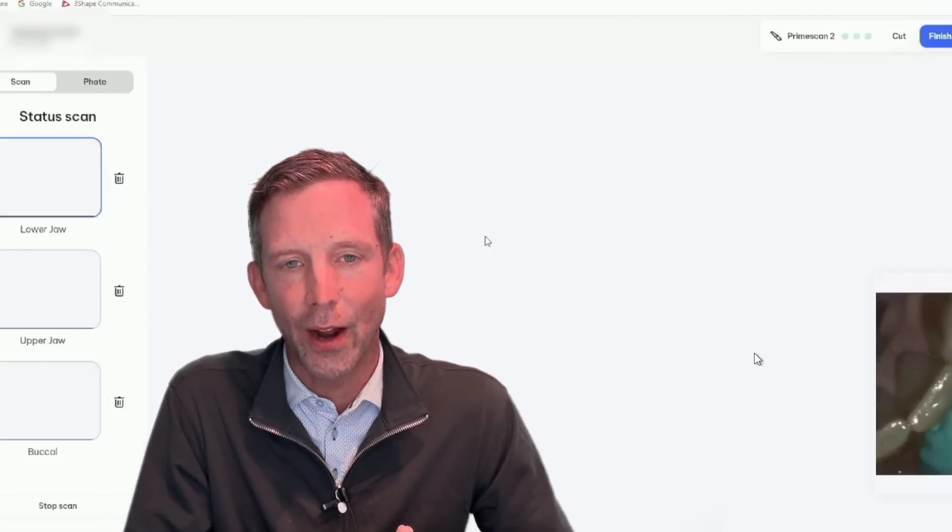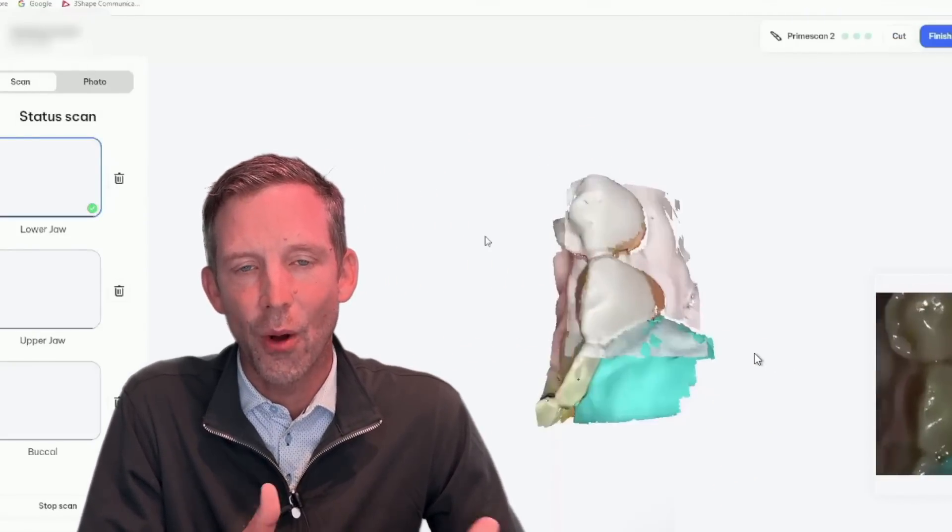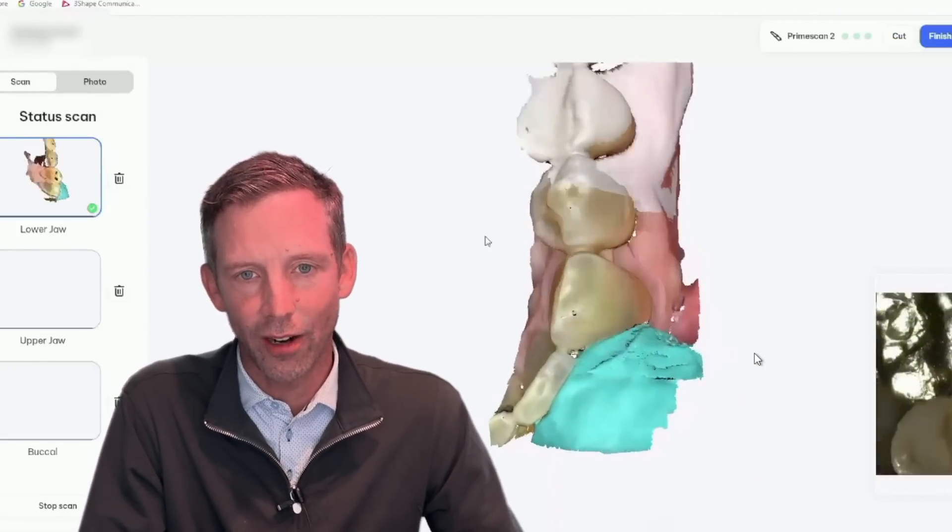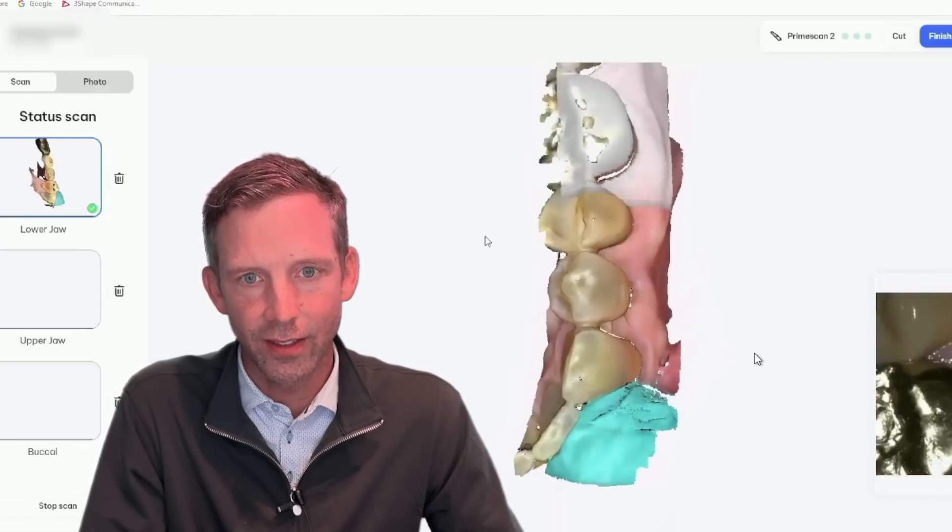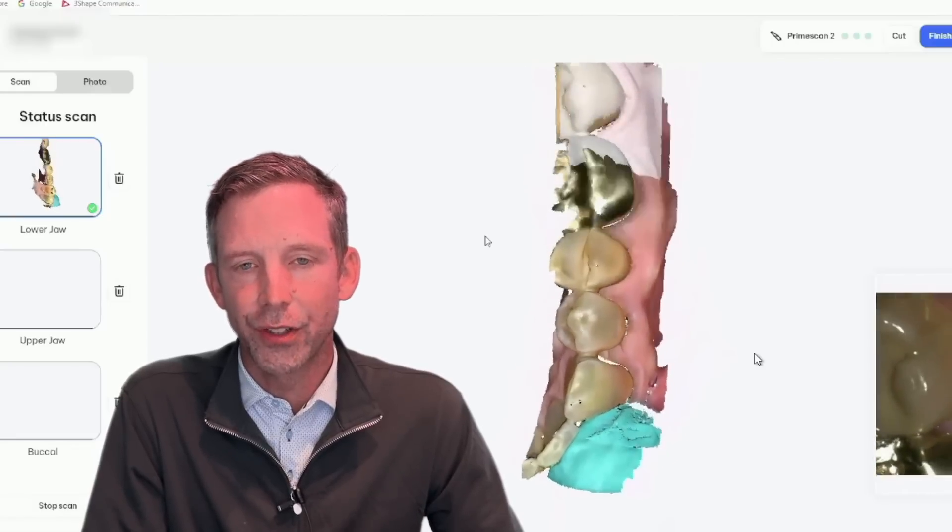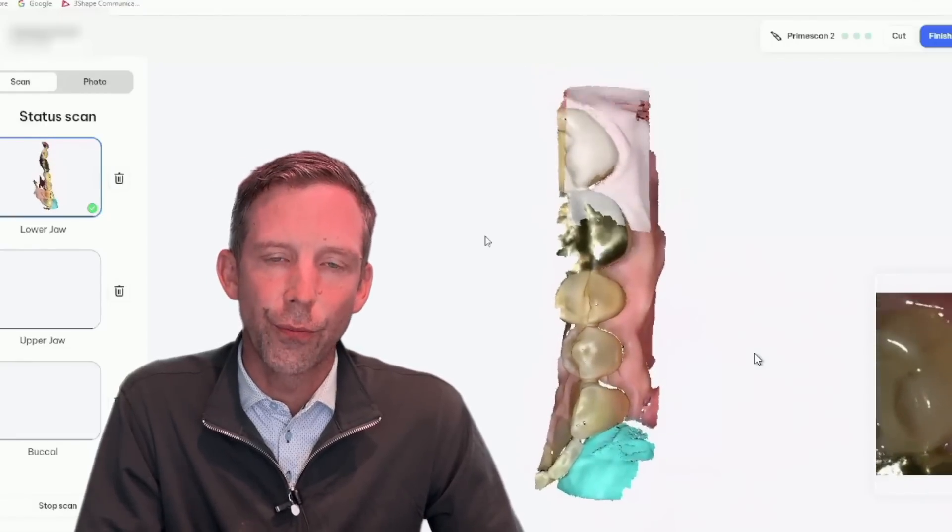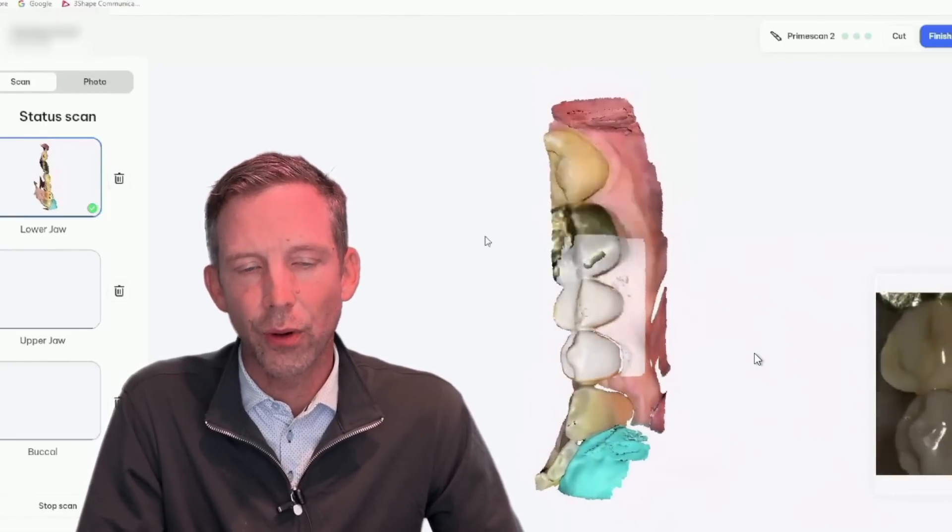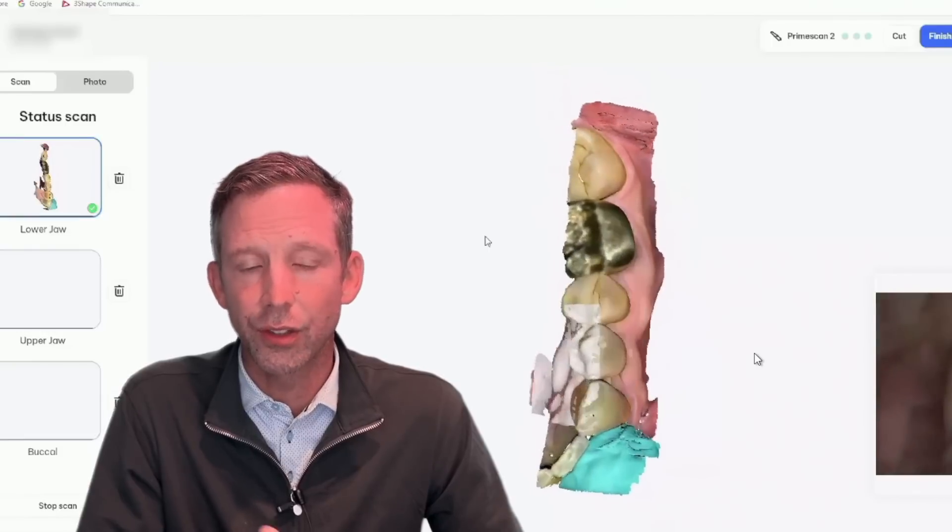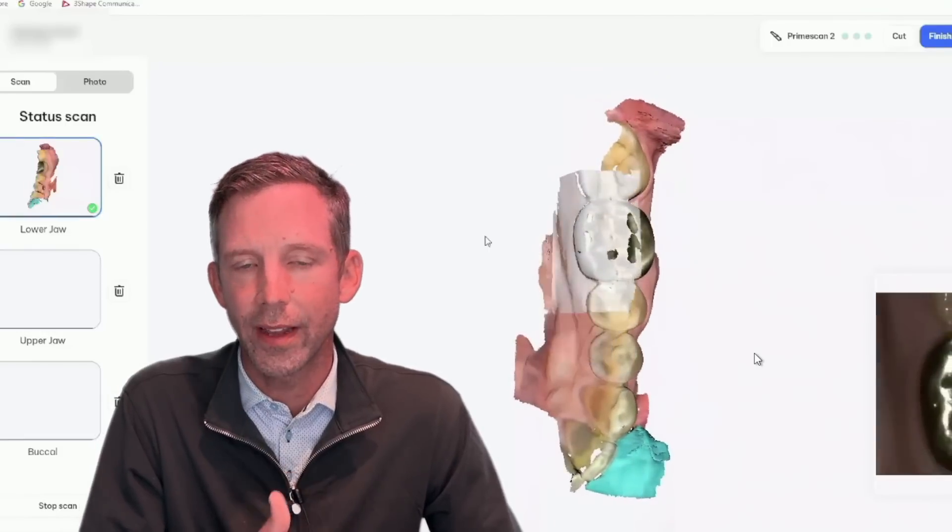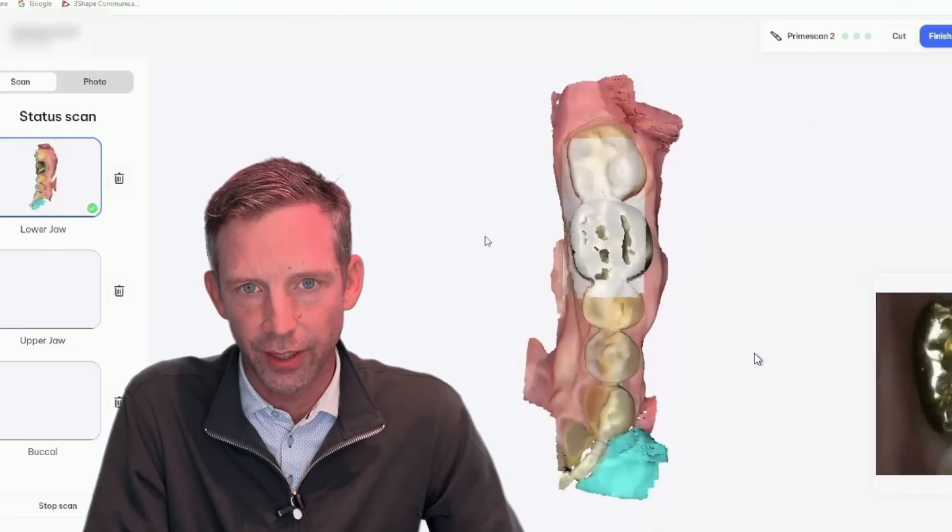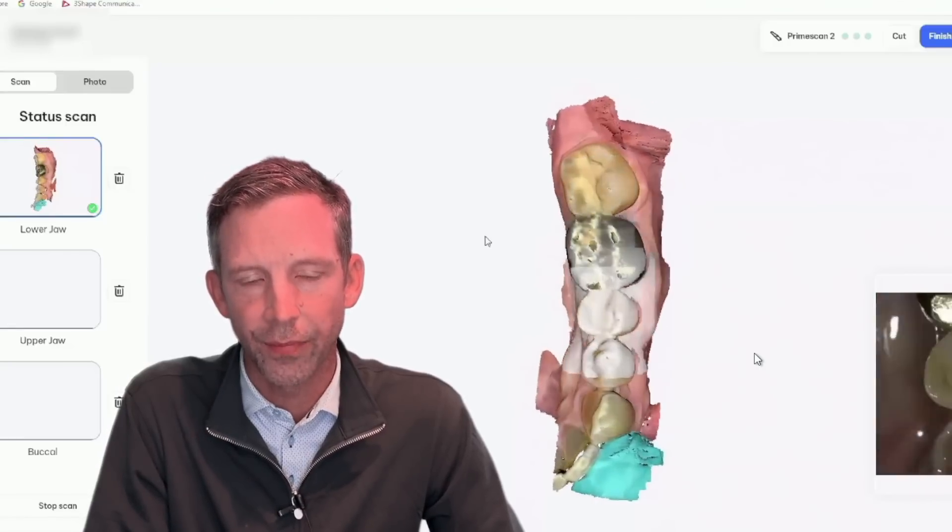So now you're seeing me go ahead and scan the lower arch on this patient. You know, there's no need to do a full arch scan on just a simple crown like this. This is going to be a treatment that we're going to do in office with our CEREC machine.